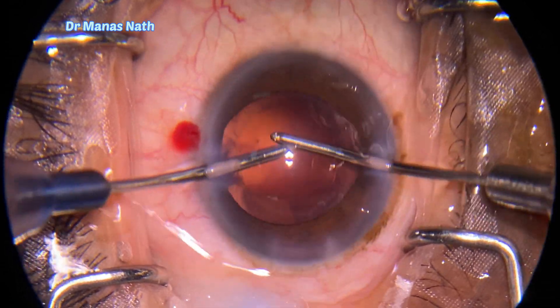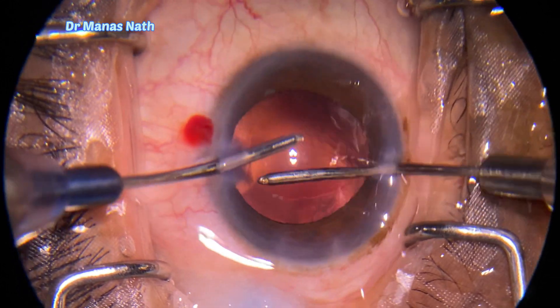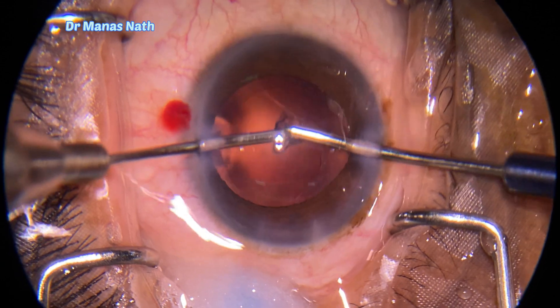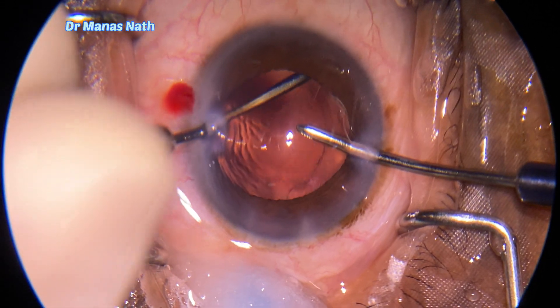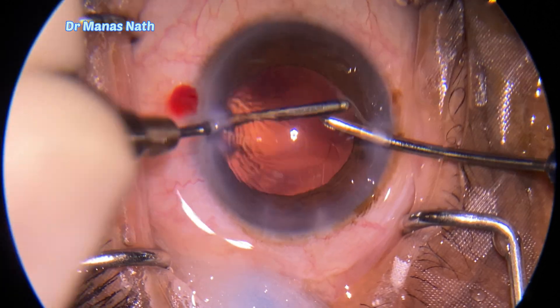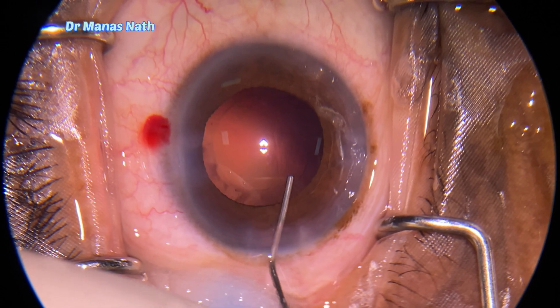I controlled the foot pedal well because as soon as I noticed the tip was going too deep, I immediately came back to foot pedal one and did not continue, otherwise I would have ended up punching through the posterior capsule as well. After removing the cortex, I'm doing hydro polish of the posterior capsule.